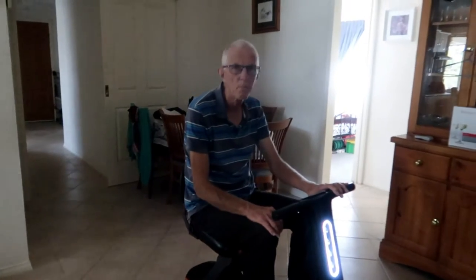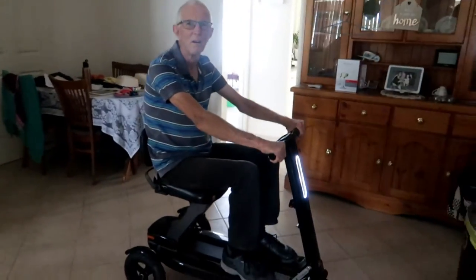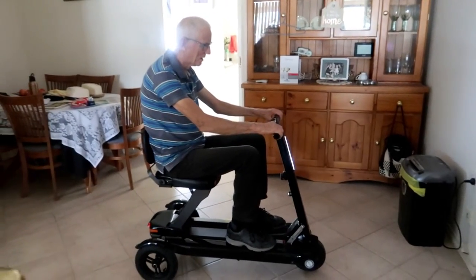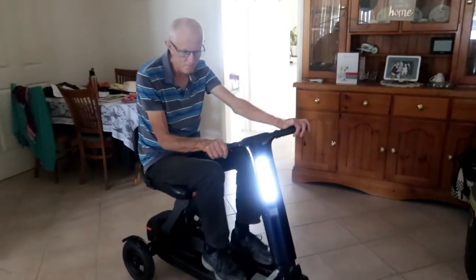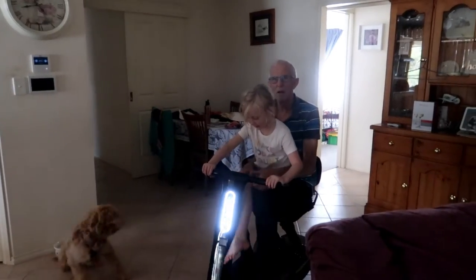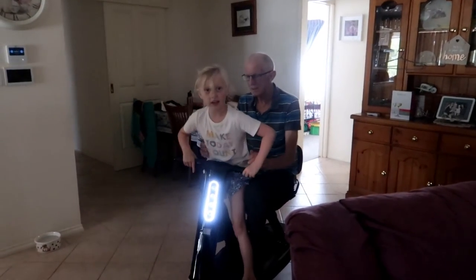Pa, tell me — what do you think of your new scooter? Very nice, lovely — very cool, very nice. Do you think it's going to help? Oh, it certainly will — it's going to help me a lot. It's going to save my knees quite a lot. Awesome!